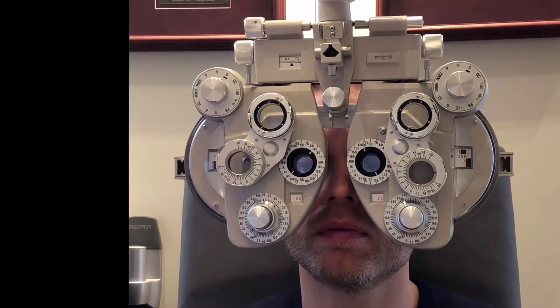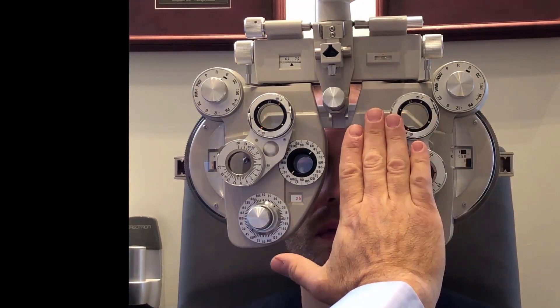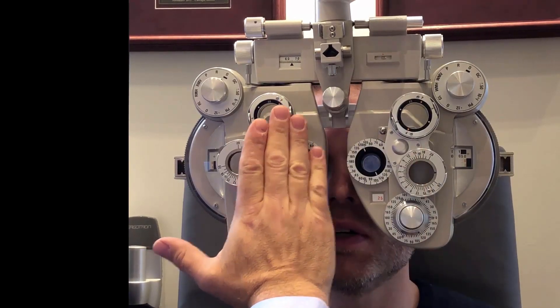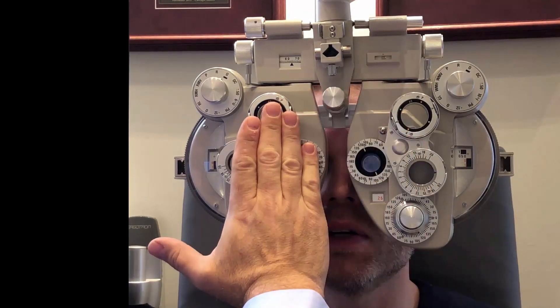It's a slightly different color, but I can see the edges of the letters at the top better. The right eye or the left? Similar. Right. They're similar.